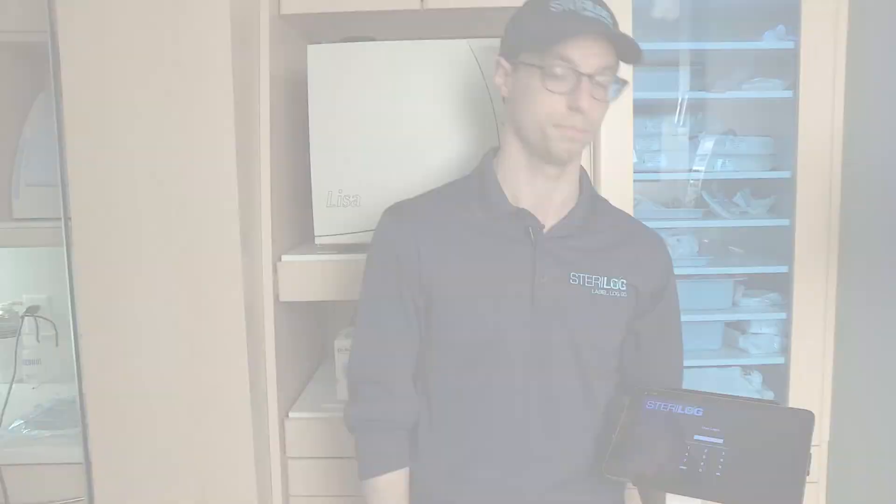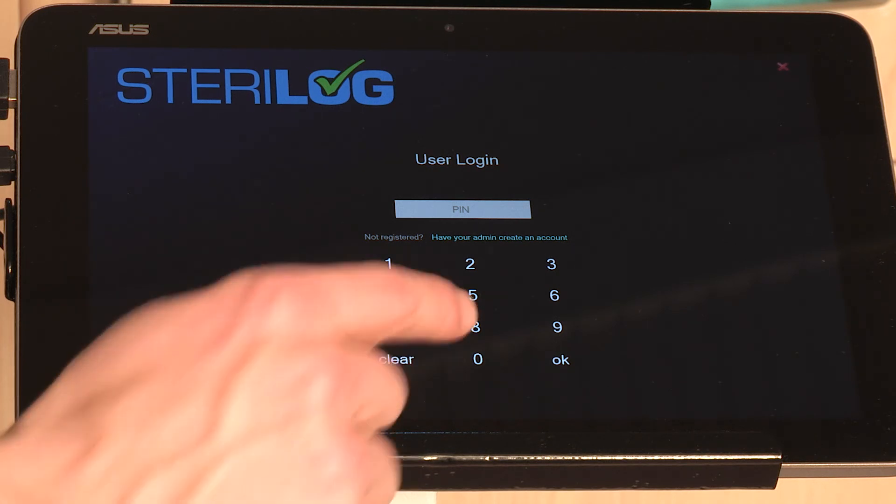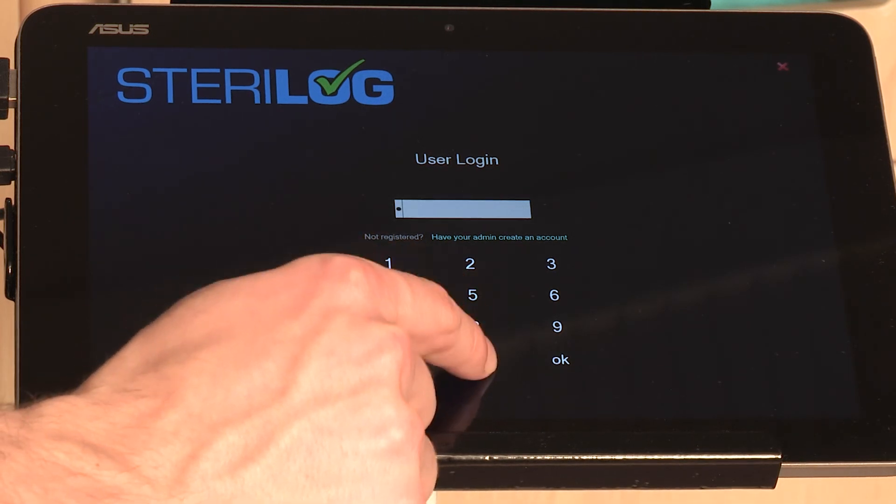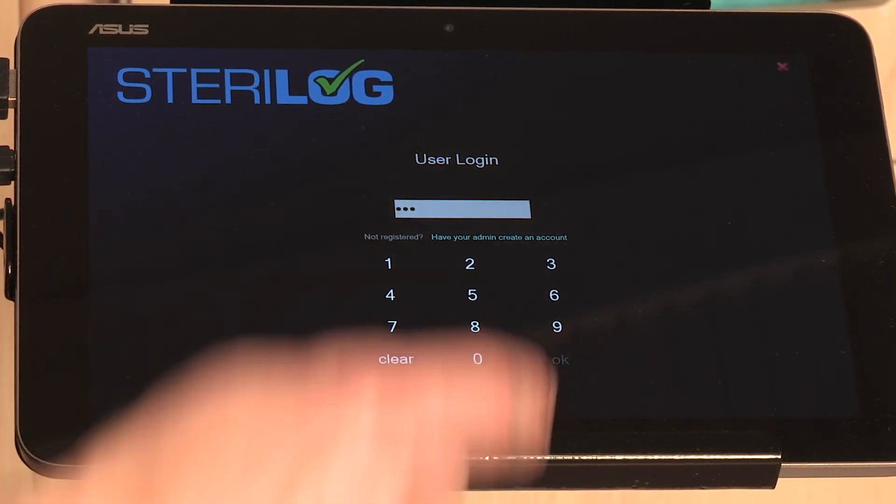Let's take a look. When you first get the system, you're going to start by logging in with the generic admin PIN which is 0-0-0 and hit OK.